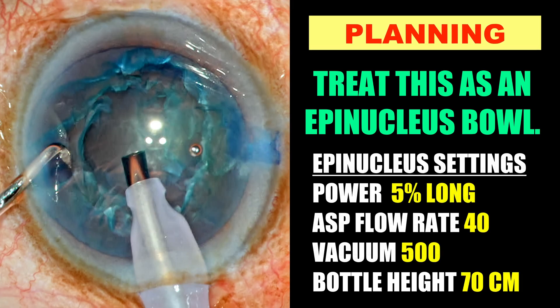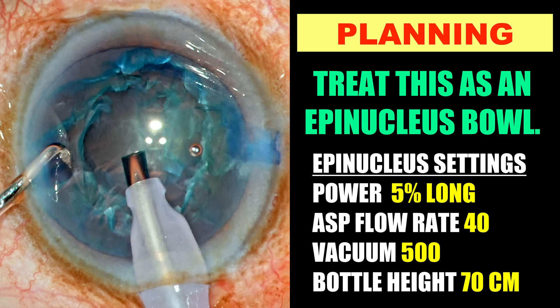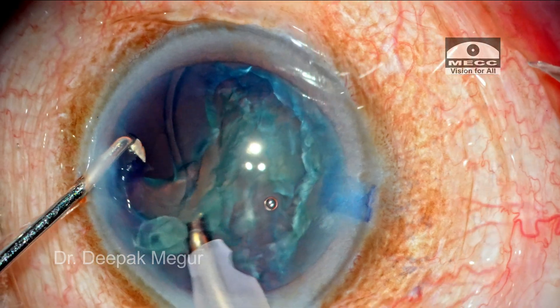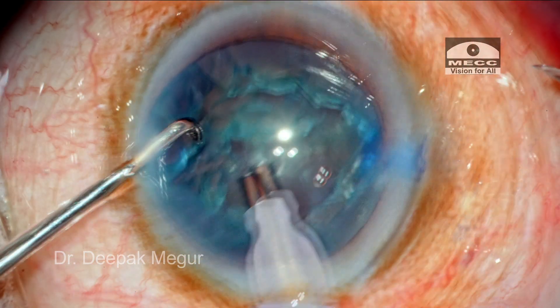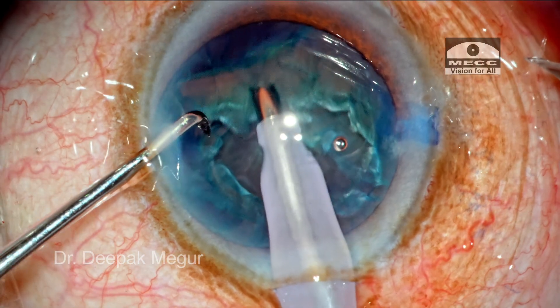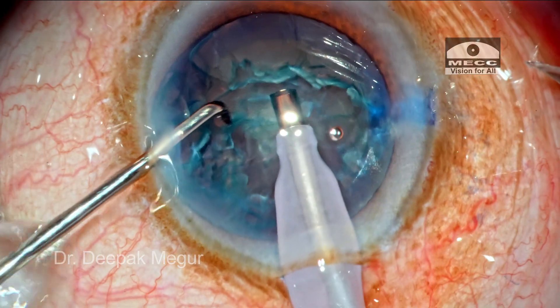The settings I am going to use are a high flow rate and high vacuum — flow rate is 40 and vacuum is around 500. The phaco power is set at 5% longitudinal. The idea is to get a grip on the anterior leaflet of the epinucleus, just hold it, and then flip it out of the bag. The initial part gets chewed off and the epinucleus is not yet flipped out, but it has reduced the diameter of the epinucleus because the peripheral part is chewed off. Now the adjacent part's anterior leaflet is held with the same phaco tip and can be flipped out of the bag quite easily.